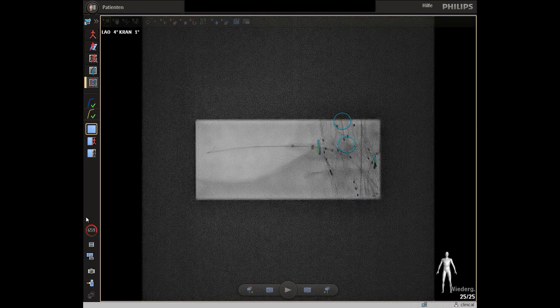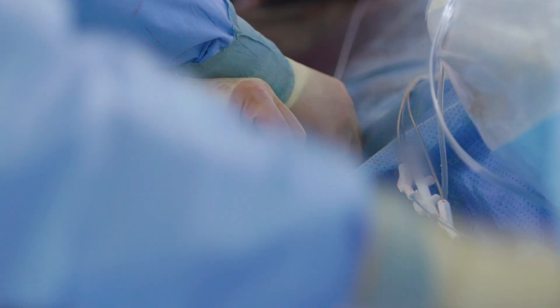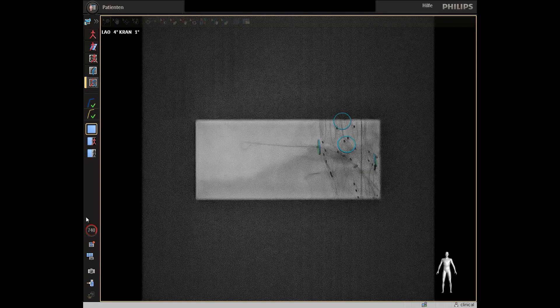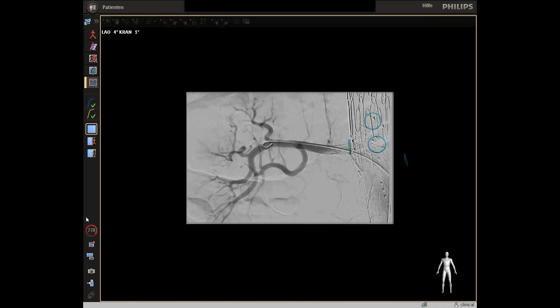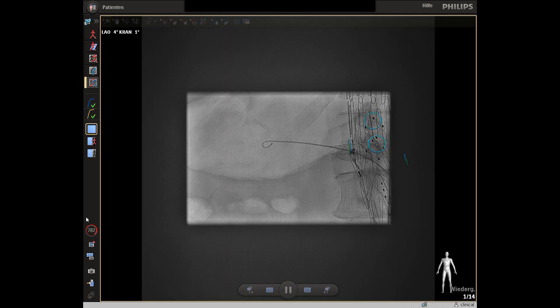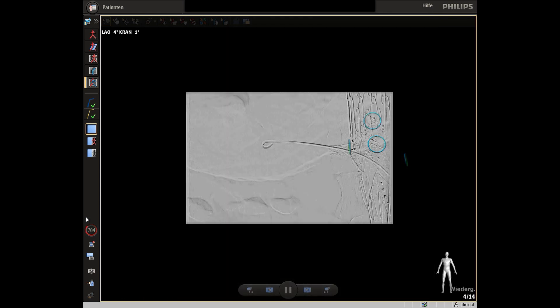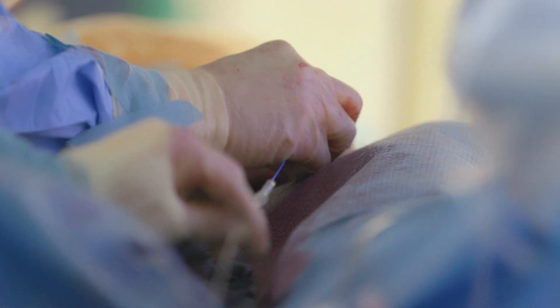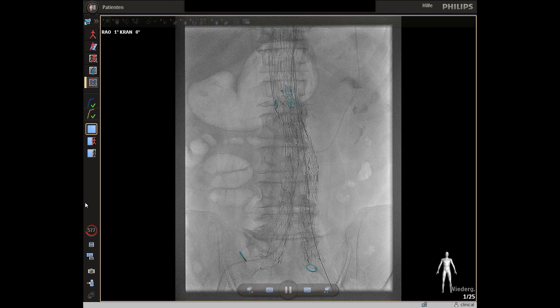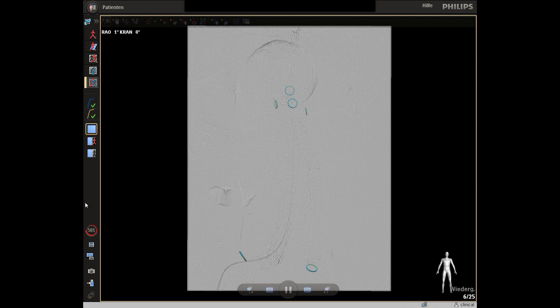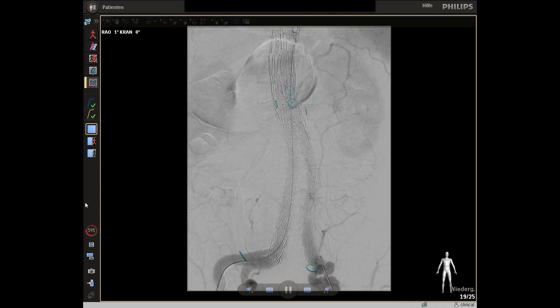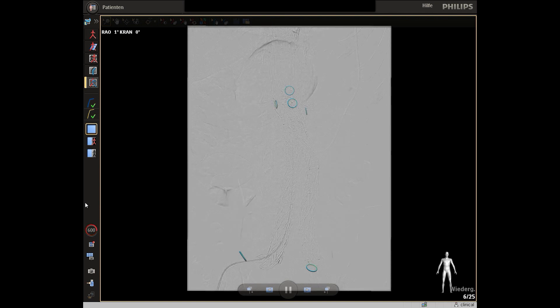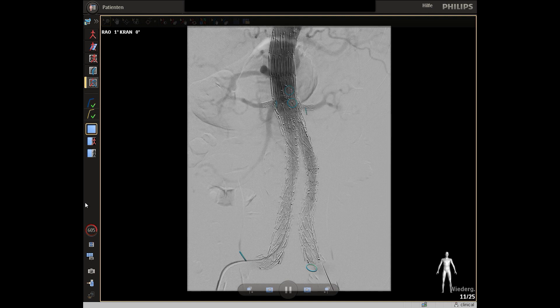A flaring balloon is used in order to get best apposition to the nitinol sealing ring of the fenestration. This is the flaring step of the right renal artery. After this, an angiography of the target vessel is done and all these steps are repeated for the other three target vessels. This is the final angiography performed with 20 cc of contrast, and we see good perfusion of all four target vessels. There is no sign of a type 1a or type 1b endoleak. There is a small type 2 endoleak, which is typical for most aortic endovascular repairs.